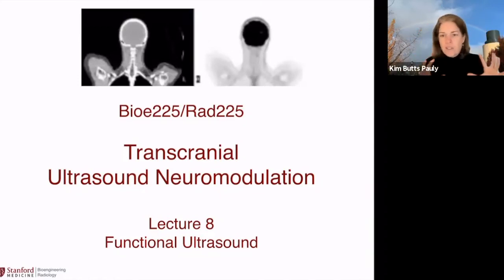It's kind of a low resolution picture, but we see the skull there and we see the brain inside, and the brain is just nothing, no real contrast there. It's just soft tissue and it's all flat gray. But the skull is bright, meaning that it's denser. That's what you see on CT.